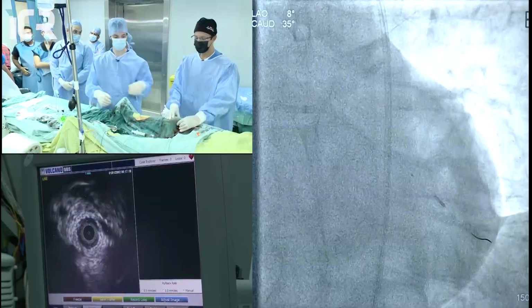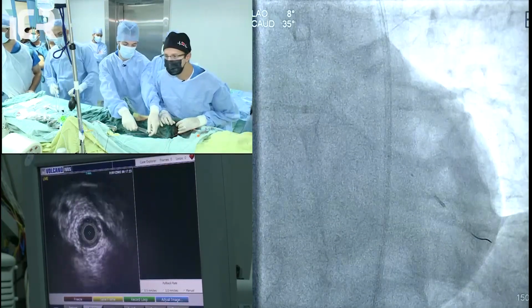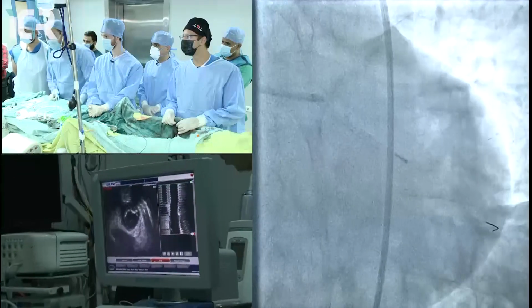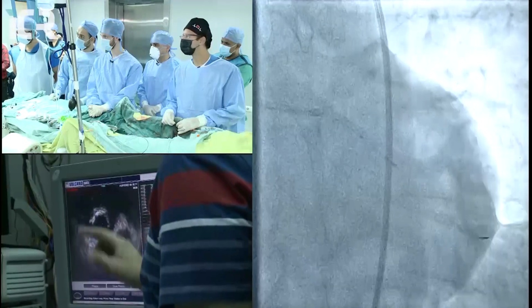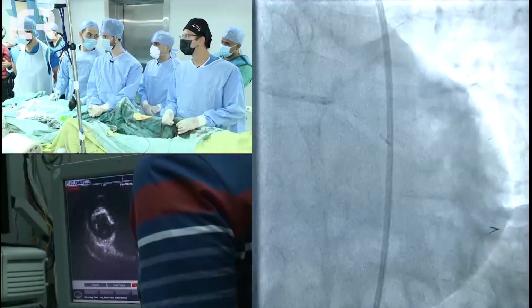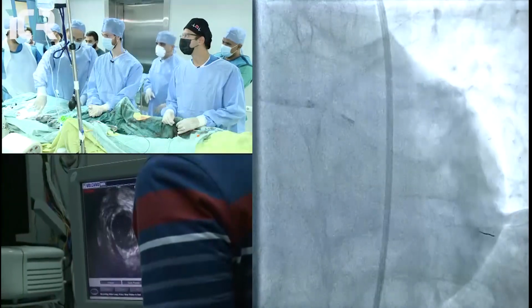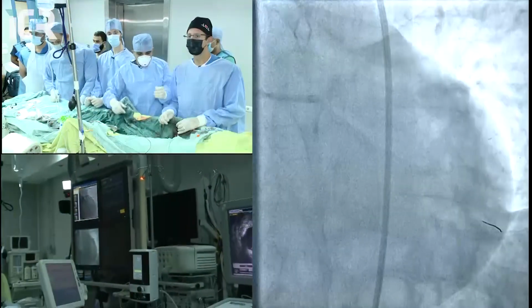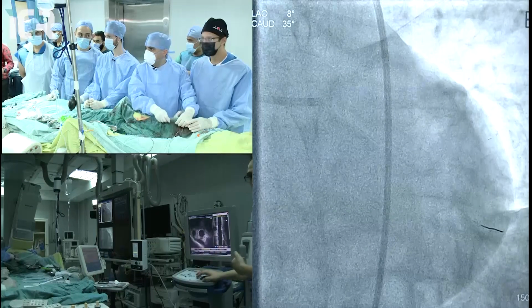And so here, as you can see, the IVUS probe passed very difficultly. I think it's a fibrotic plaque and some calcium. This is the 180 degree calcification. So there is an arc of calcium of at least 270 degrees at a certain point.